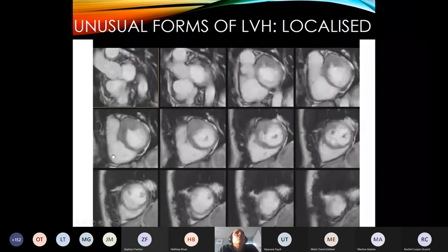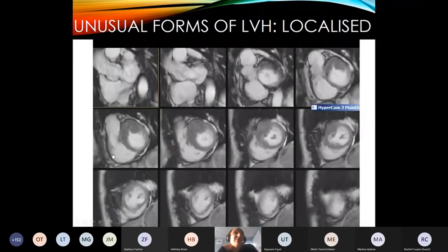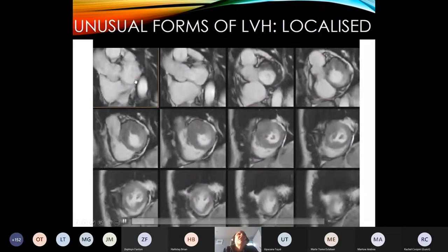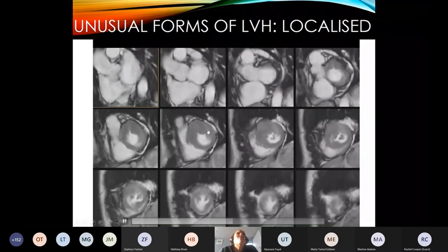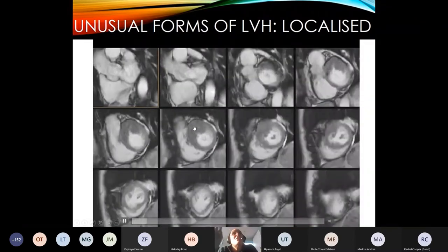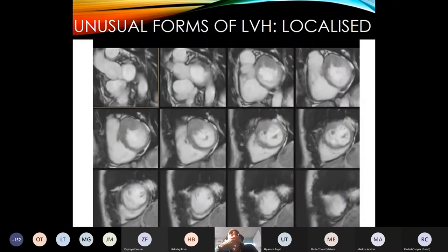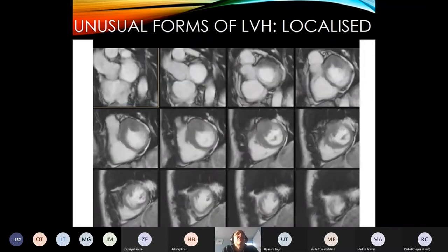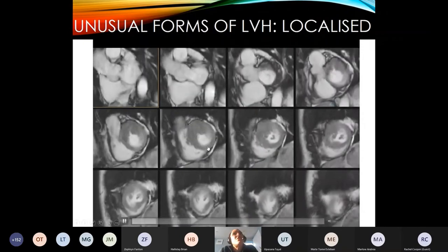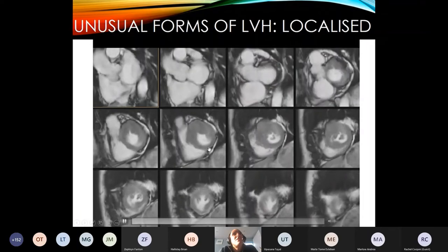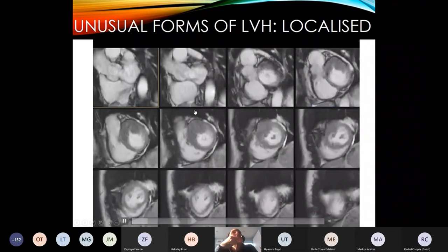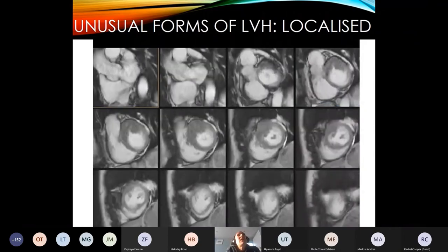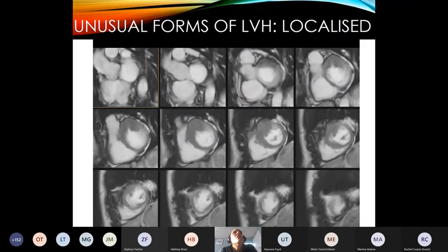Sometimes you can get unusual forms of hypertrophy that are more localised. This was an interesting case from when I was doing my PhD — echo actually missed this. There was a really abnormal ECG in a patient with family history. What you're seeing here is really impressive hypertrophy of the anterior wall. You do see it on echo, but it was so odd that the sonographer probably thought they had an odd cut and it wasn't pathology. On MRI it's easy to see this area is really abnormal. MRI gets you out of jail a little bit in a case that's odd like this.